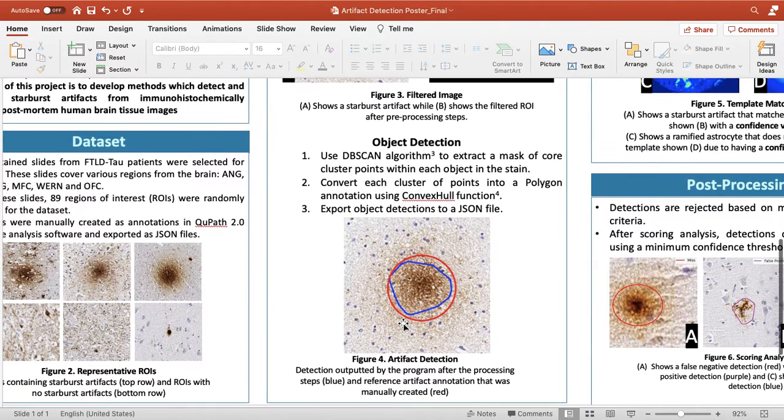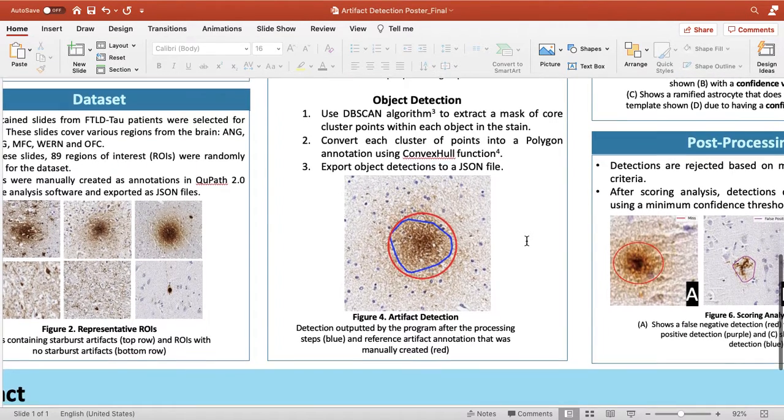Later, we have our object detection steps, where we use a clustering algorithm known as dbScan, which extracts core points within the artifact image, and we then are able to convert this into a polygon and extract the object using a script that converts it into a JSON file.